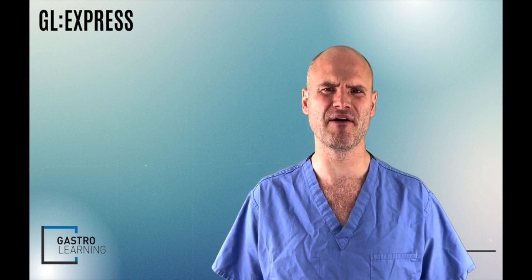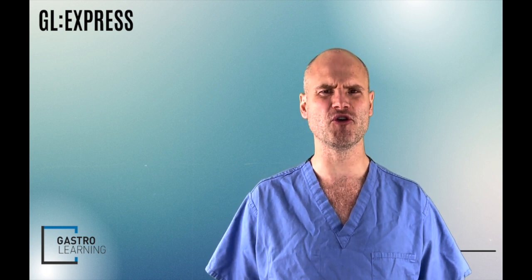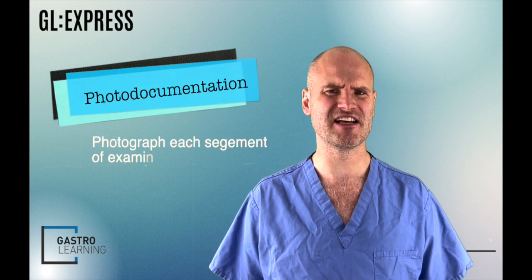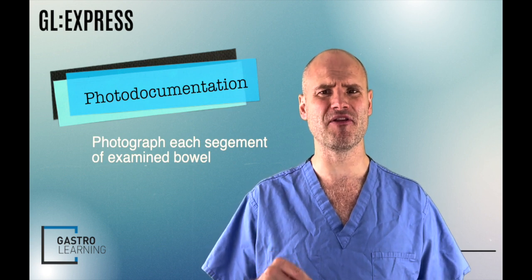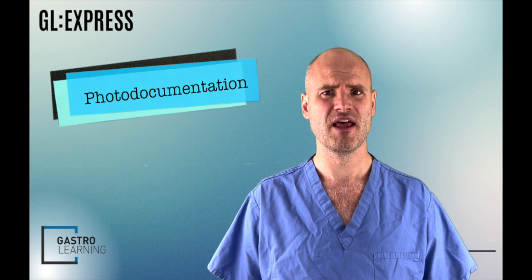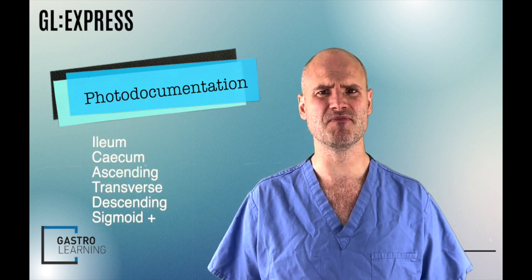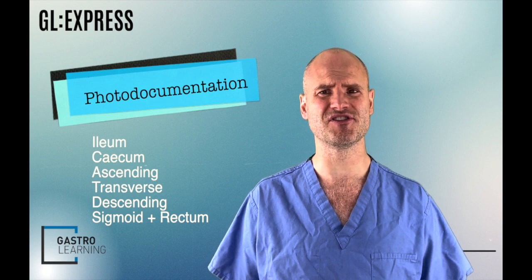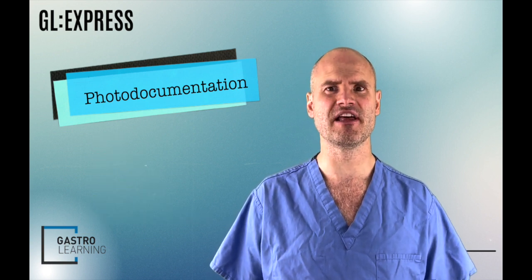on the GastroLearning platform. So, firstly, they talk about the importance of photo documentation and suggest that in inflammatory bowel disease colonoscopy, each segment of the bowel that is inspected is photographed. Therefore, they recommend photos to be taken of the ileum, cecum, ascending, transverse, descending and sigmoid colon and the rectum. Additionally, they recommend that photos should be taken of any lesions that are seen.